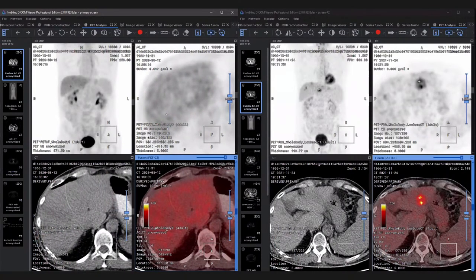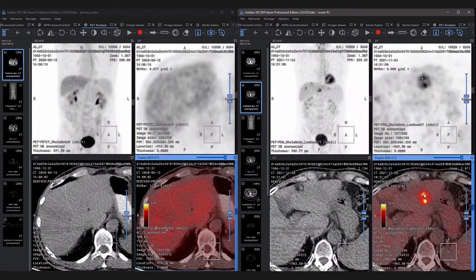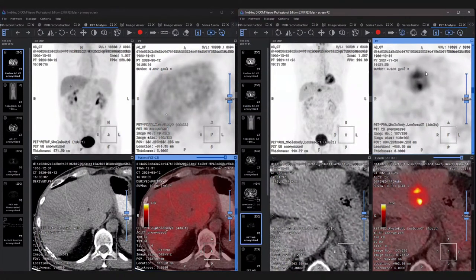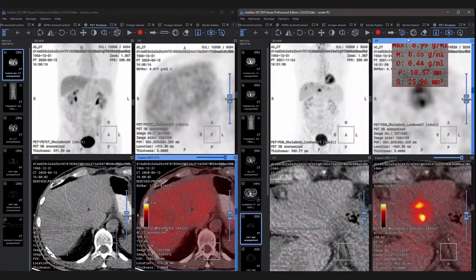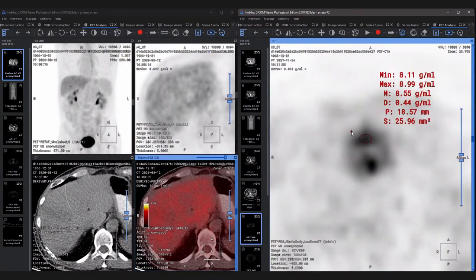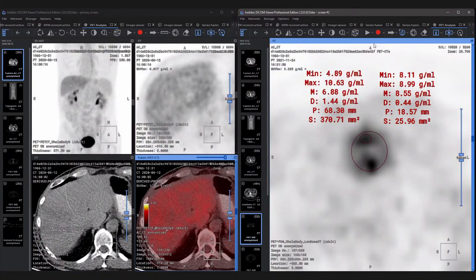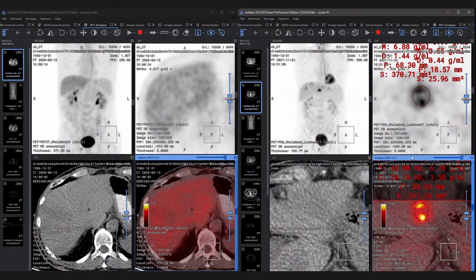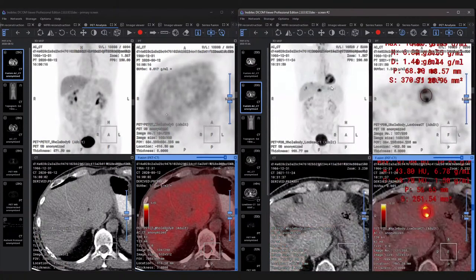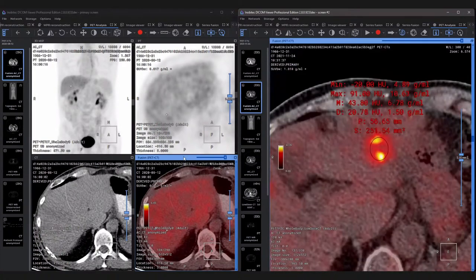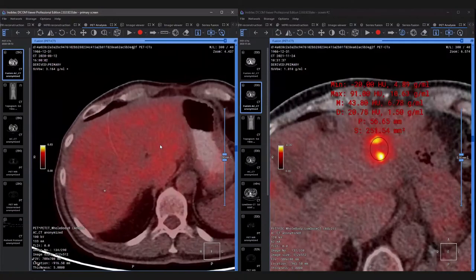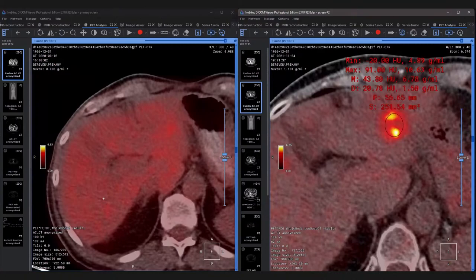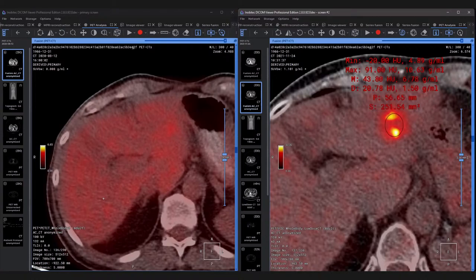It's the same patient, almost one year apart. One was done on November 24th, 2021 and the second one was done on August 12th, 2020. As you can see, there is a liver metastasis. And as you can see, the FDG uptake is about eight. Of course we can do just the FDG uptake measurement. We can do it in volume as well, or we can combine the measurement of the FDG uptake with measurement of density.